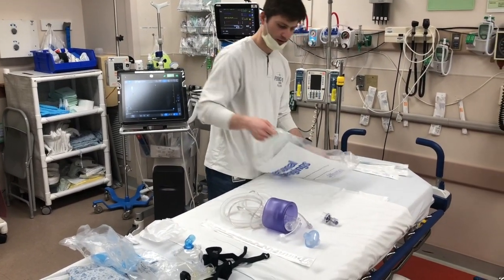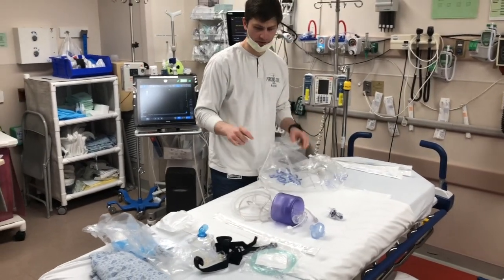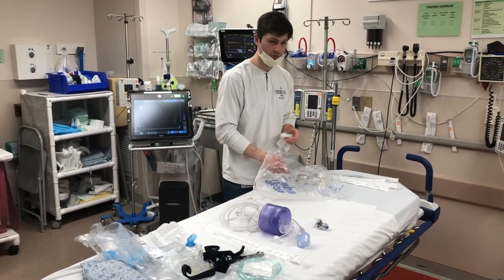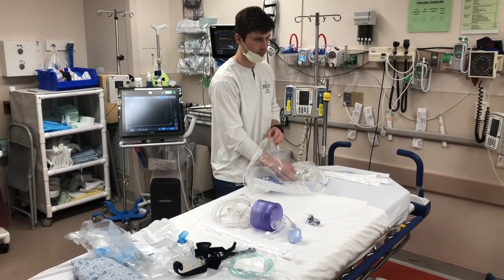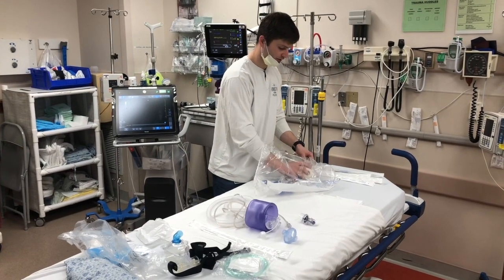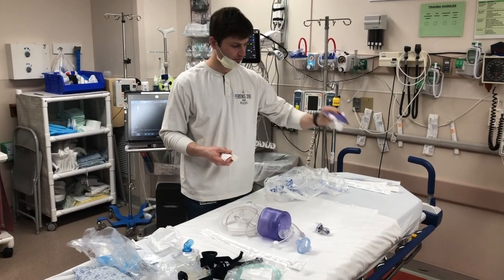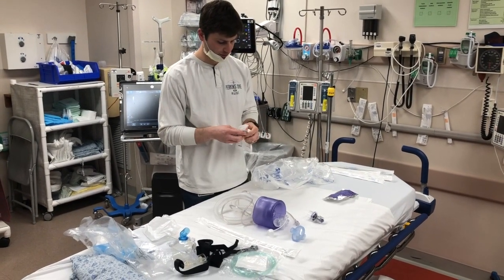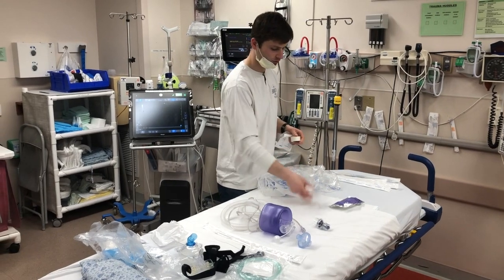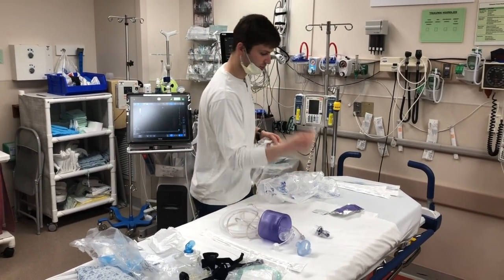You'll need a nasal cannula also, so that's in there as well. That's going to create the circuit for pre-oxygenating the patient, but we're presuming that 99% of these patients are going to get intubated. We also have the end-tidal CO2 detector that you'll use after you intubate the patient, surgical lube because you're obviously going to want to lube up your endotracheal tube, and a 10cc syringe to put the cuff up.